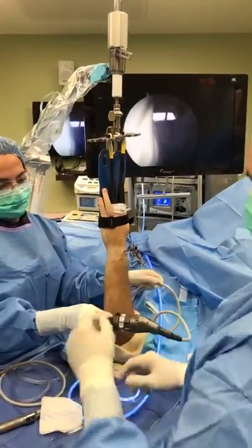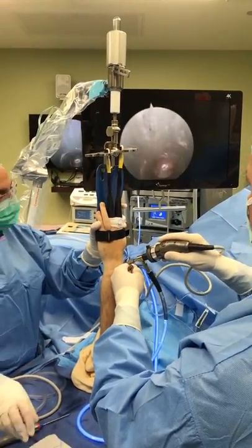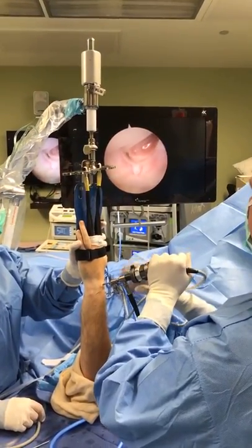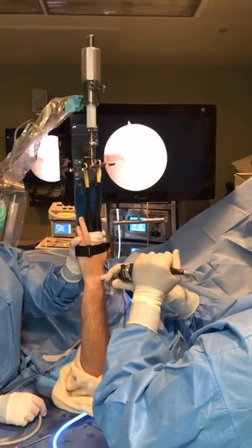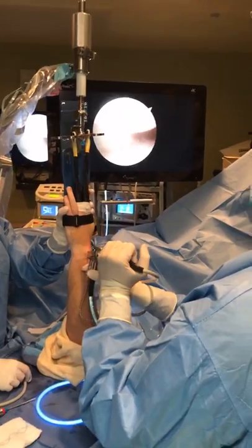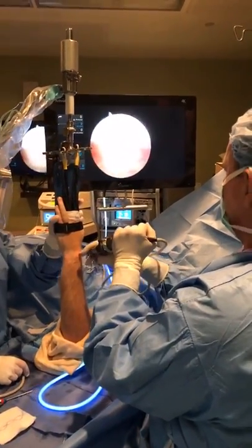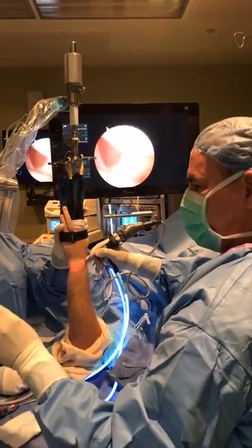Okay, so we're inside the wrist joint now. And you're gonna see it momentarily. Lights off. Okay, immediately I see a bubble and some blood, little blood vessels you can see there, and that means it's inflamed, right? So obviously it's inflamed, he has pain. No surprise there. These are the normal palmar volar ligaments. This is the scaphoid bone. For those who understand a little bit about anatomy of the wrist, the scaphoid is the most fractured small bone in the wrist, very common, complex problem. But what I'm suspecting in him is a cartilage tear.